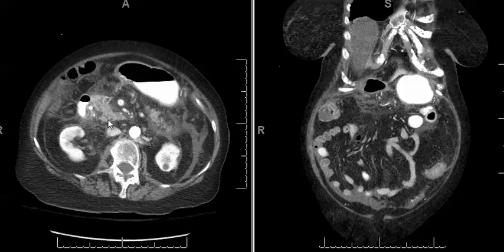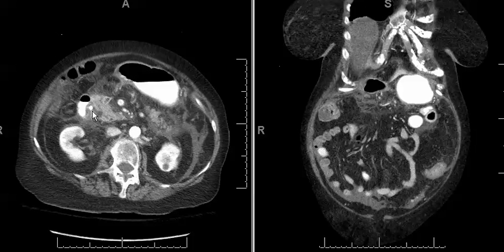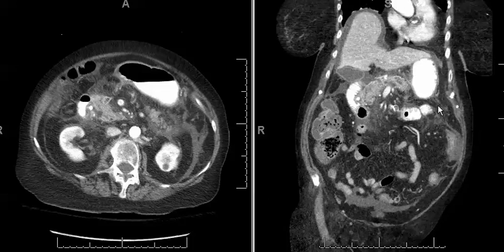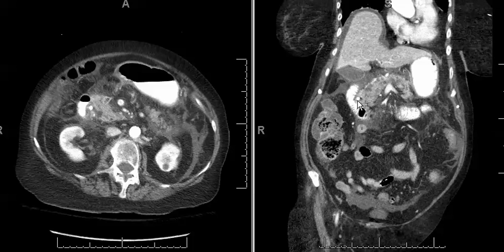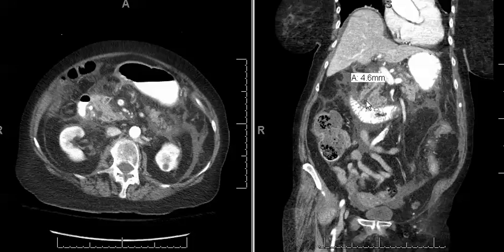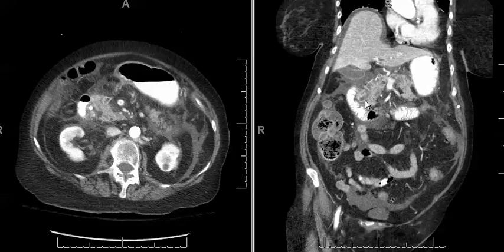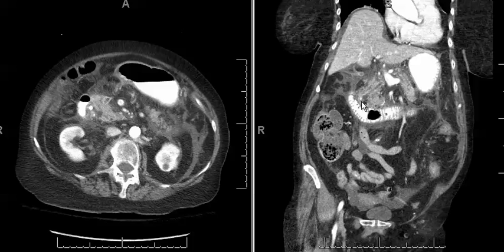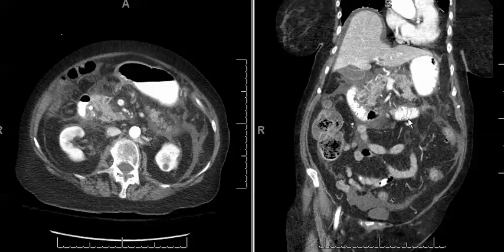As we continue to scroll down we notice that there's a radiopaque stone centered in the common bile duct. This becomes more apparent on the coronal sequence where we have a stone which measures 5-7mm here in the common bile duct, and more distally there was another smaller stone as well. The coronal image makes it easier to appreciate that most of the edema is actually centered around the pancreas.